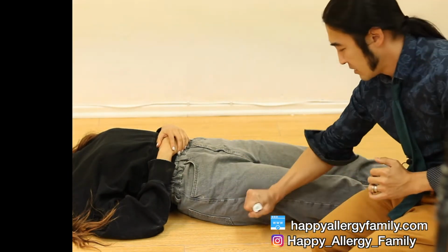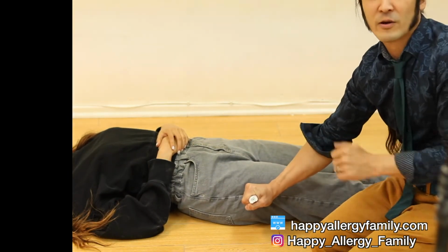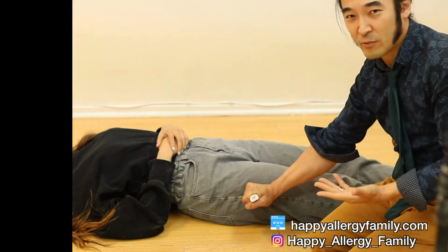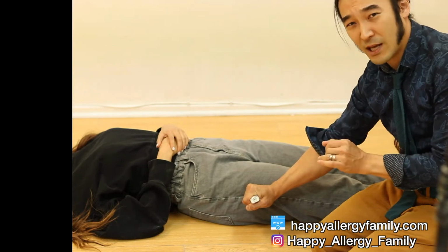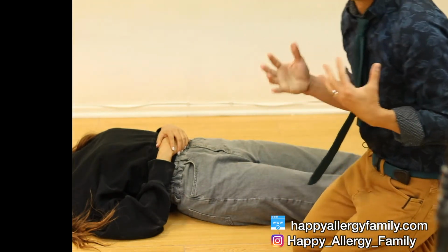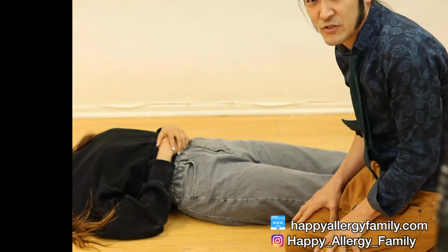So we're going to take it, apply force. You hear that click. We're going to count to 3 slowly. 1,000, 2,000, 3,000. The medicine has now been applied. I'm going to slowly remove it. And then, of course, we're going to follow up by calling 911 for help, and we're also going to check to see how she's doing.